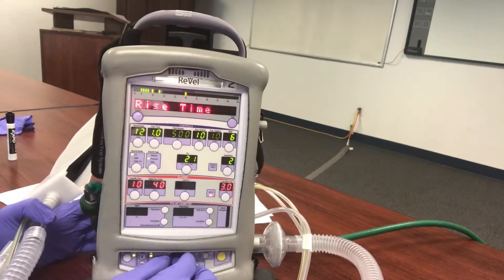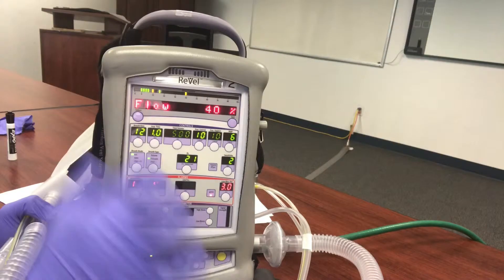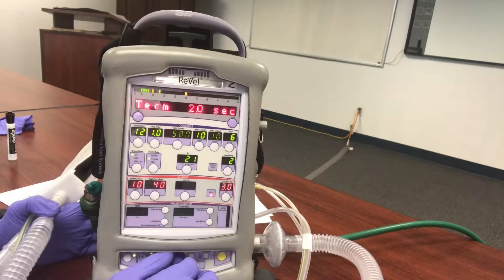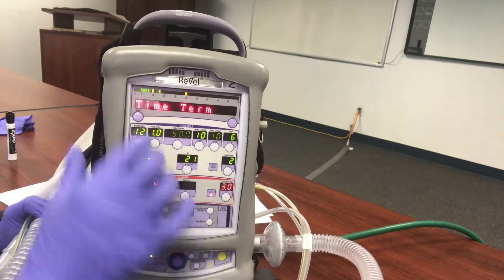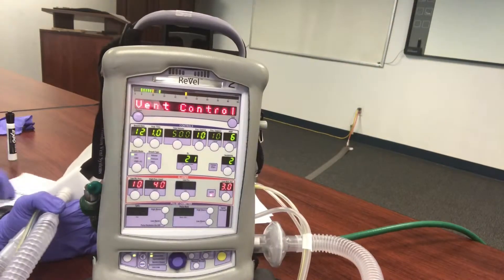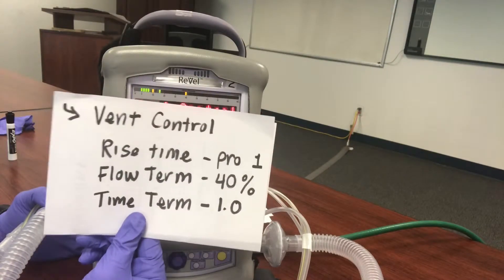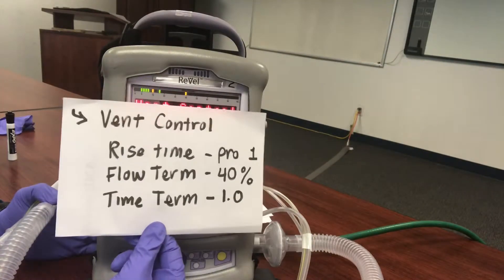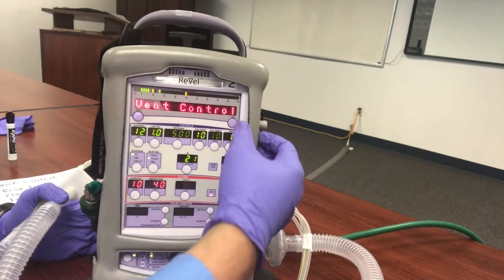Go to Vent Control, then Flow Term, and change it from 25% to 40%. Then go to Time Term and change it from 2 seconds to 1 second. This just gives you a more comfortable breath. As a cheat sheet: Vent Control → Rise Time → Profile 1, Flow Term 40%, Time Term 1.0. You can screenshot this and keep it in your phone. Now we have it all ready to go.